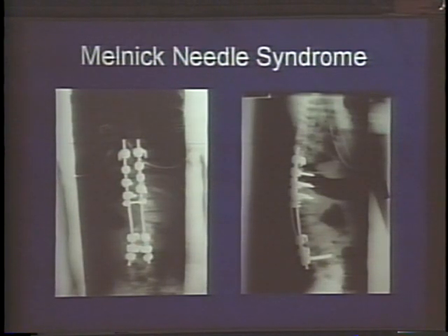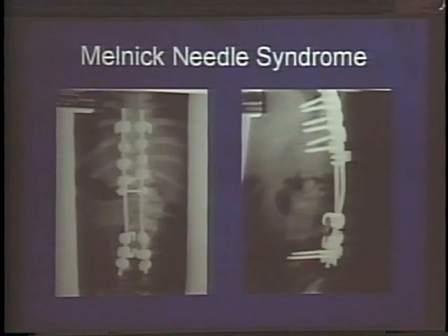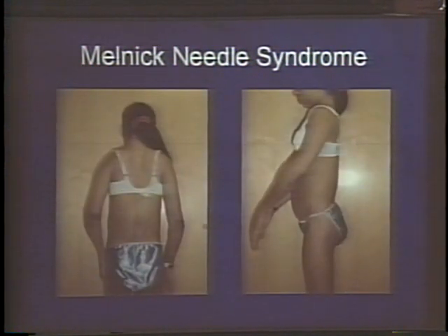And this was done all posterior with a pedicle subtraction osteotomy at the apex. Her pedicles were so small I was unable to get screws in several of the levels, and accordingly hooks were used. And I was very happy we did not do an anterior approach, as she was intubated on ventilator support for 28 days after this procedure. And this is at 2 years. Everything remains exactly as it was. And this is her clinical appearance with significant improvement in her kyphotic posture.